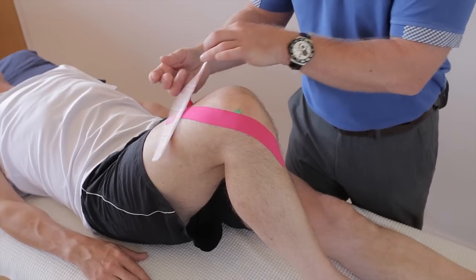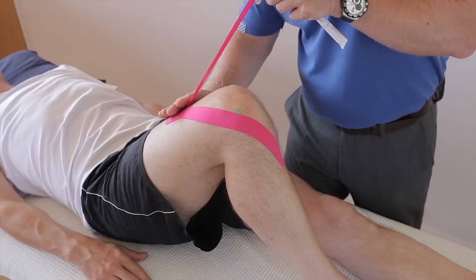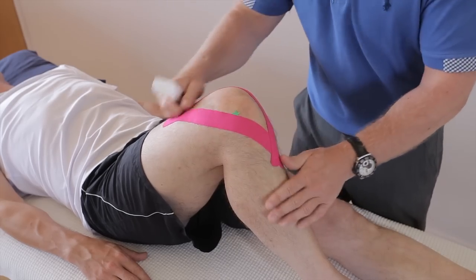Do exactly the same on this side — peel it back, apply with very little stretch, come around, and finish on the tibial tuberosity.